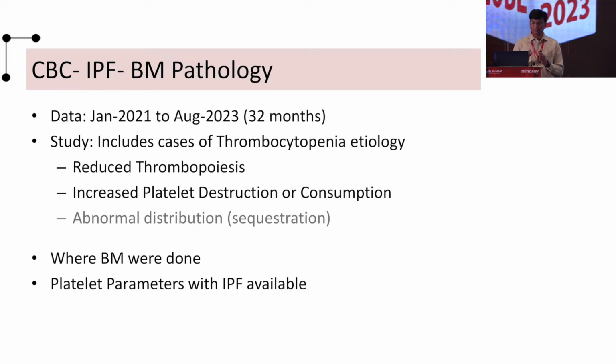Now coming to the CBC, IPF and bone marrow pathology. In the subconscious, I'm sure it was helping me a lot, but I didn't have data. So Mindray called me and asked, why can't you do some study? Then I took the data. I took bone marrow data from January 2021 to August 2023, for 32 months.